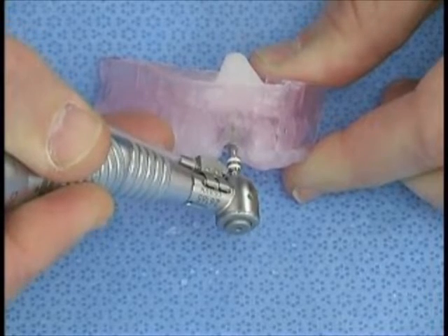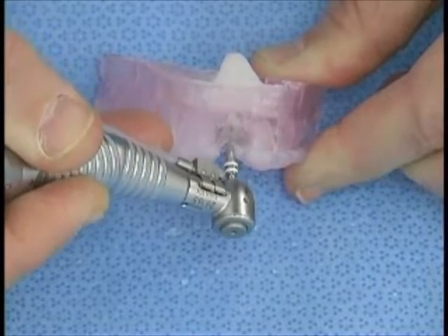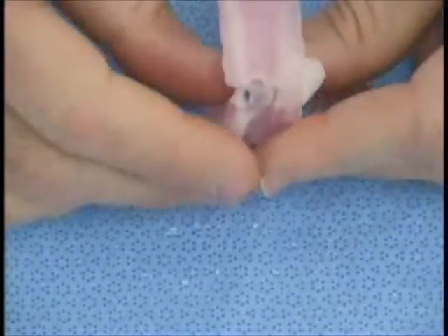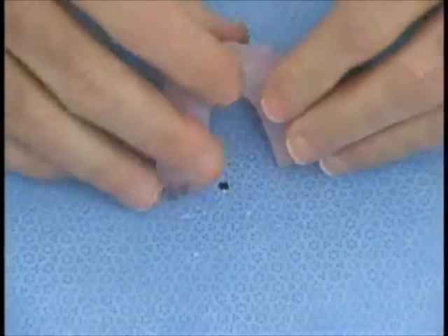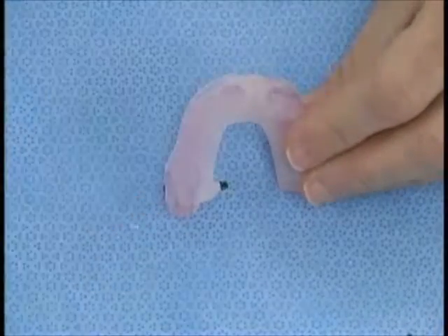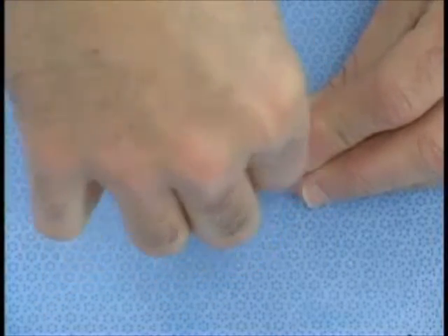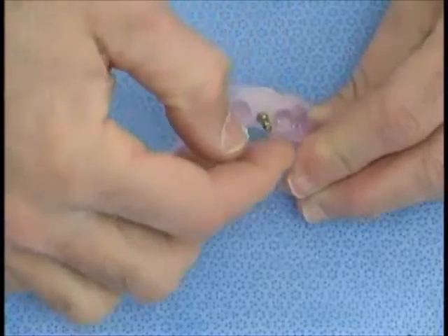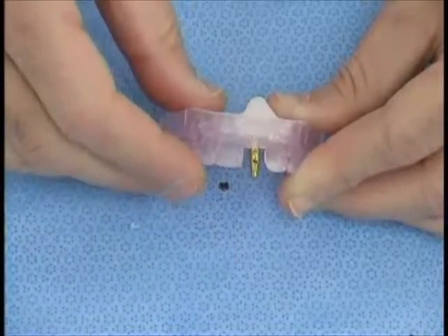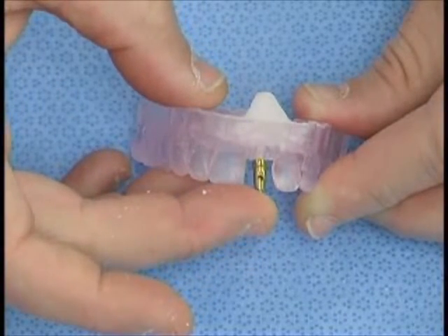And literally take it, in this case, almost to the hub. Just like in the surgical component, we can even try in some of the try-in abutments at this time. And you can go in with either an angulated abutment and try to see how that would line up, in essence, how an angulated abutment may line up relative to the adjacent teeth, or whether you would in fact need to utilize a straight abutment.